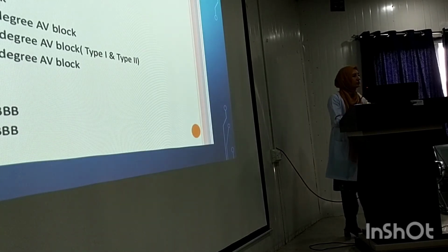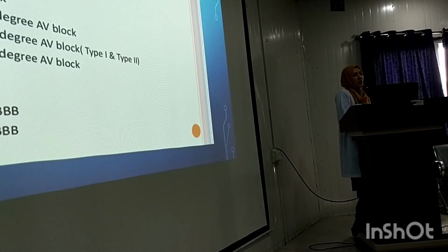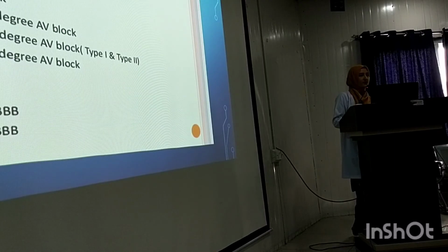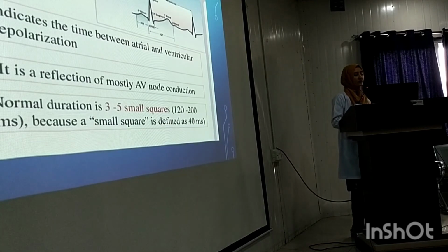We have a patient in private room. He has beautiful ECGs of his rhythm changes on daily basis. One day he is in sinus rhythm, the next day he has first degree heart block, and then it changes to a second degree heart block. So he has really nice ECGs. If anybody of you is interested in, we have already talked about the bundle branch blocks, the left bundle and the right bundle branch blocks. So we won't be going into the details of that.